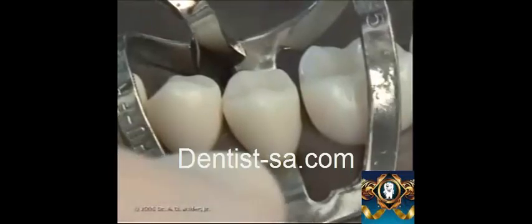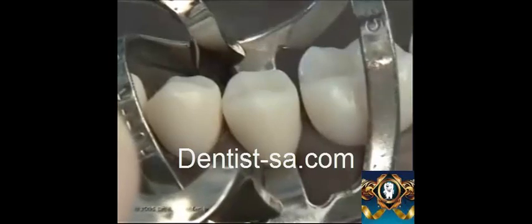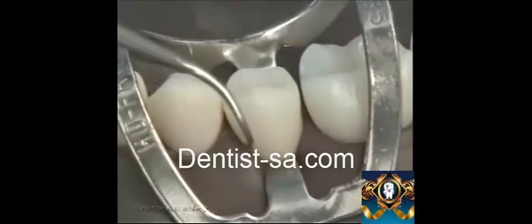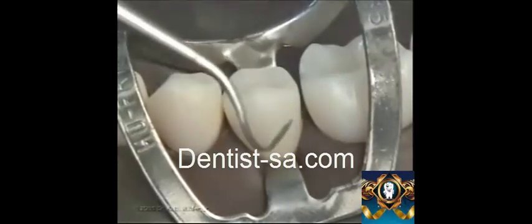The placement has been finished. Now the gingival retraction is being checked using an explorer.